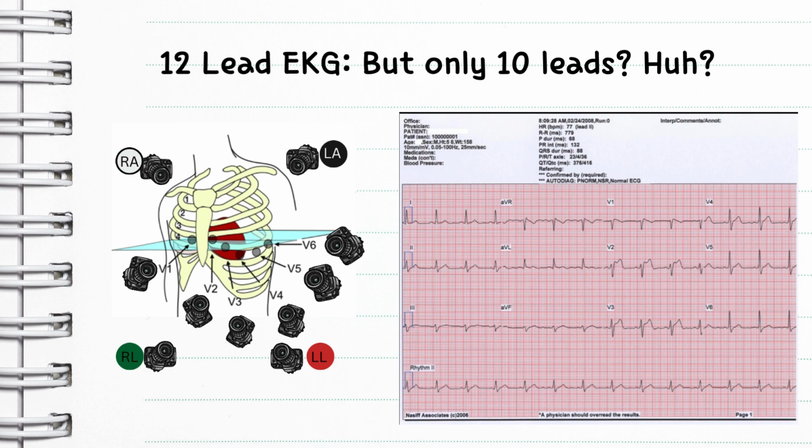Okay, so how this comes together is there are 3 standard limb leads. That's lead 1, 2, and 3. By the way, side note, don't stress about memorizing what I'm talking about right now. This is purely so that you understand what you're looking at. You will not be questioned on this. You just need to have an understanding of what you're looking at. That's different angles, and you can stop there. But this is just for your own information.